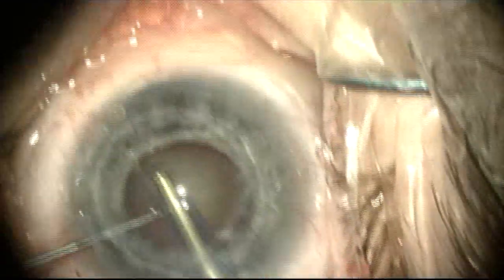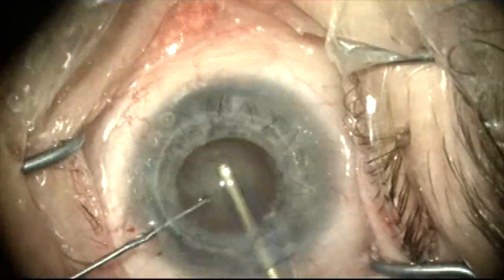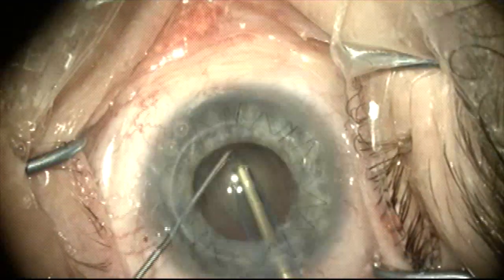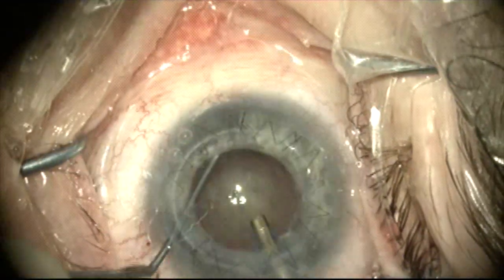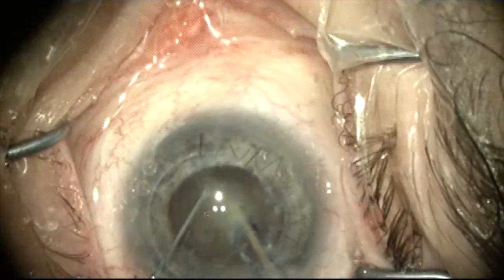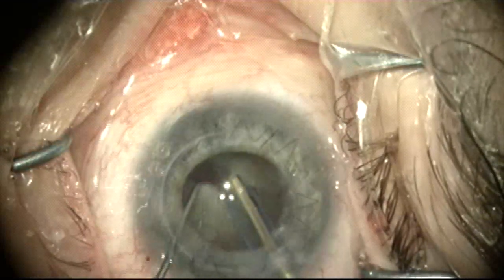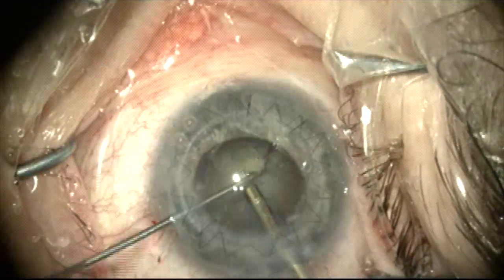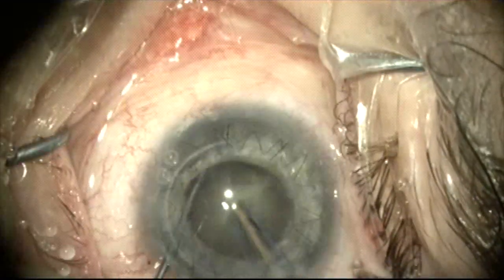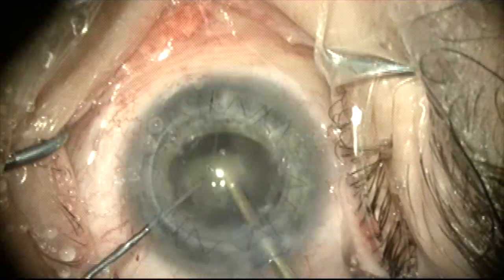Here I'm going to use a standard chopping technique that I use in most of my cases. I'm going to reach around behind the nucleus with a phaco chopper and then drive into the lens and split the nucleus in two. Rotate the lens and repeat the chopping maneuver. This is a nice technique because it puts very little stress on the zonules.